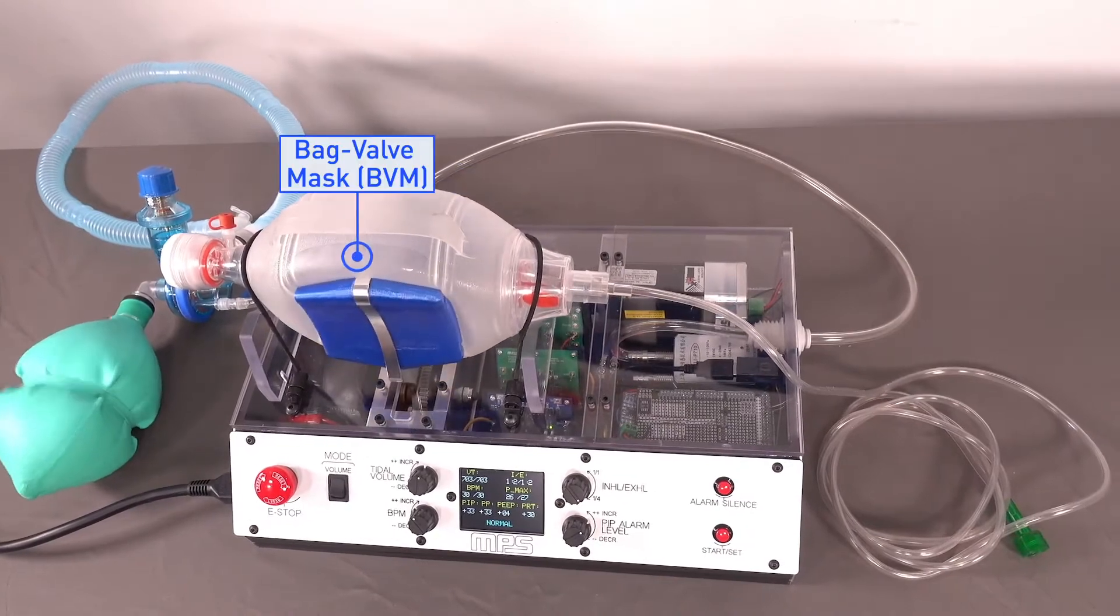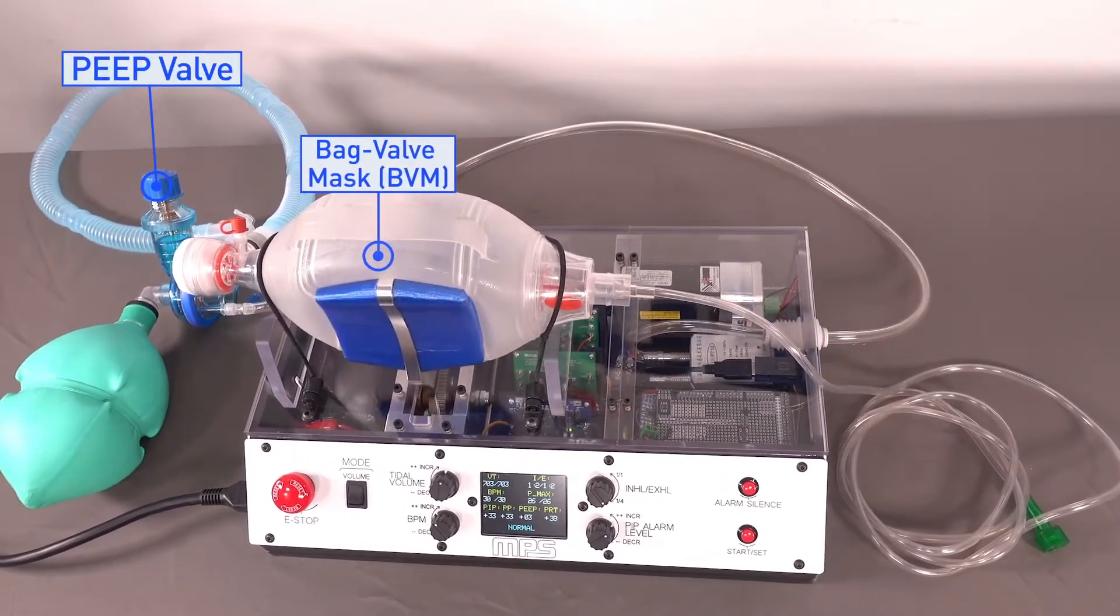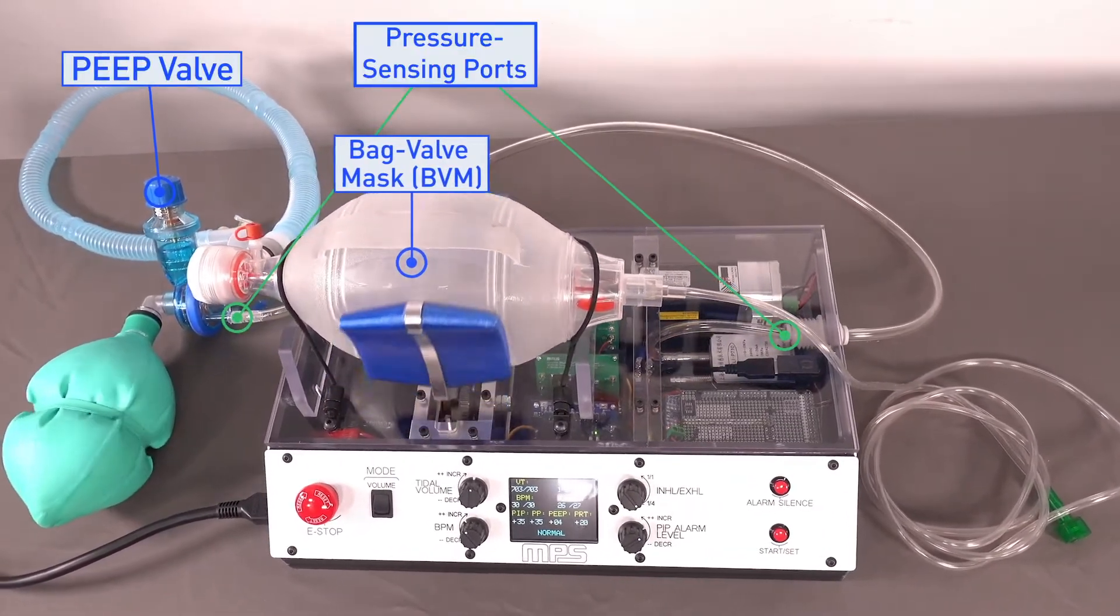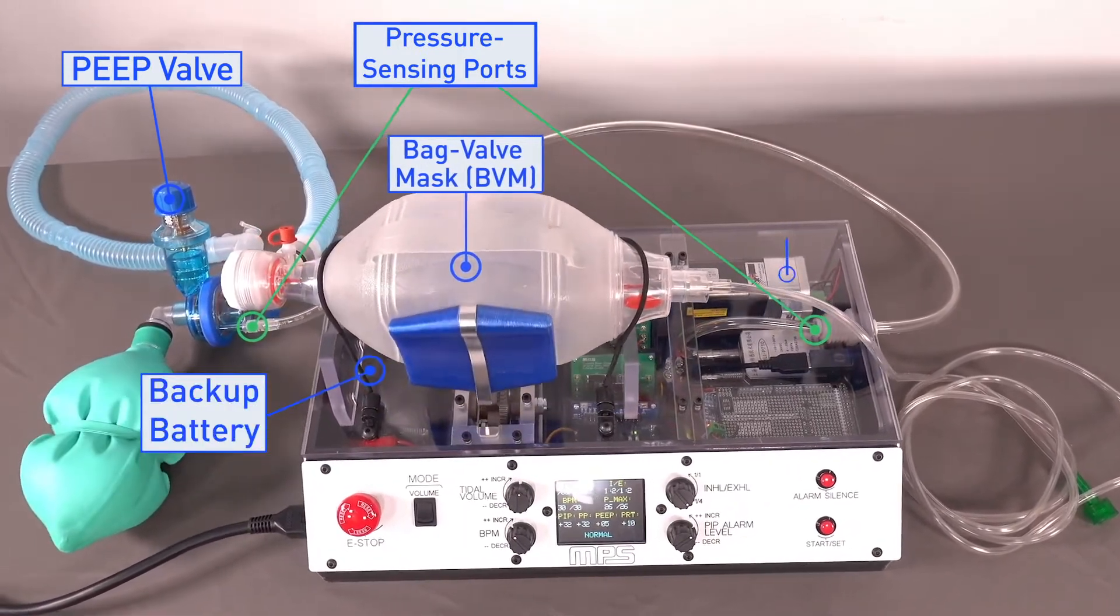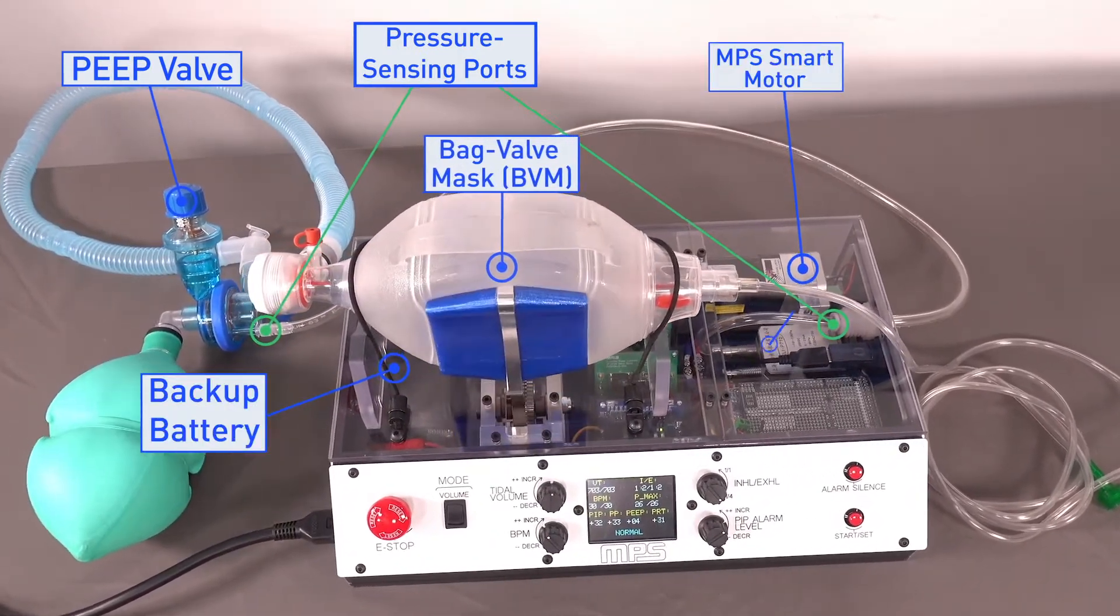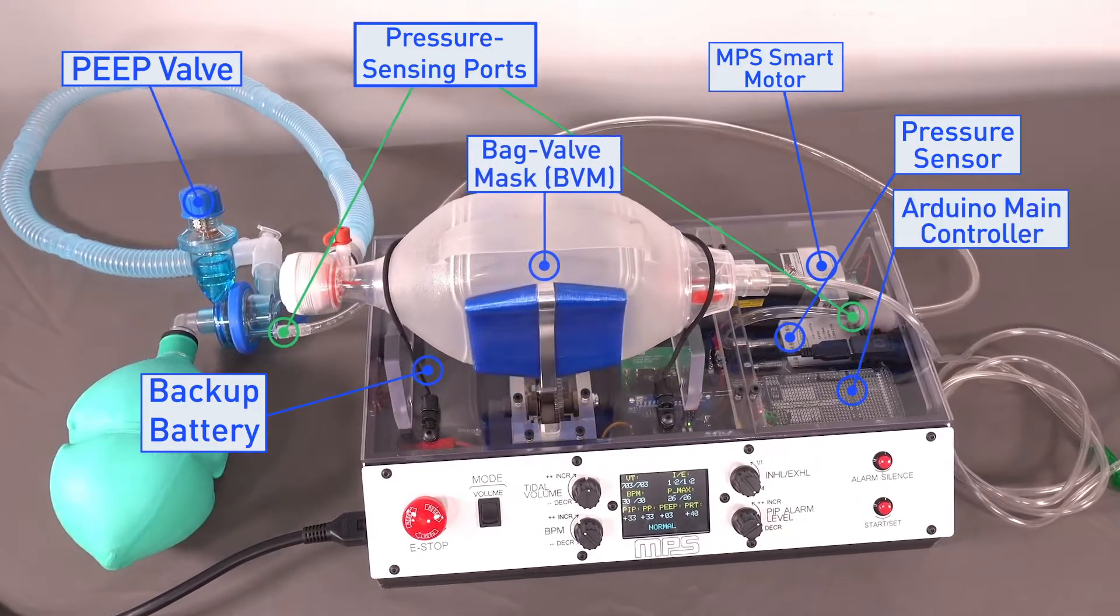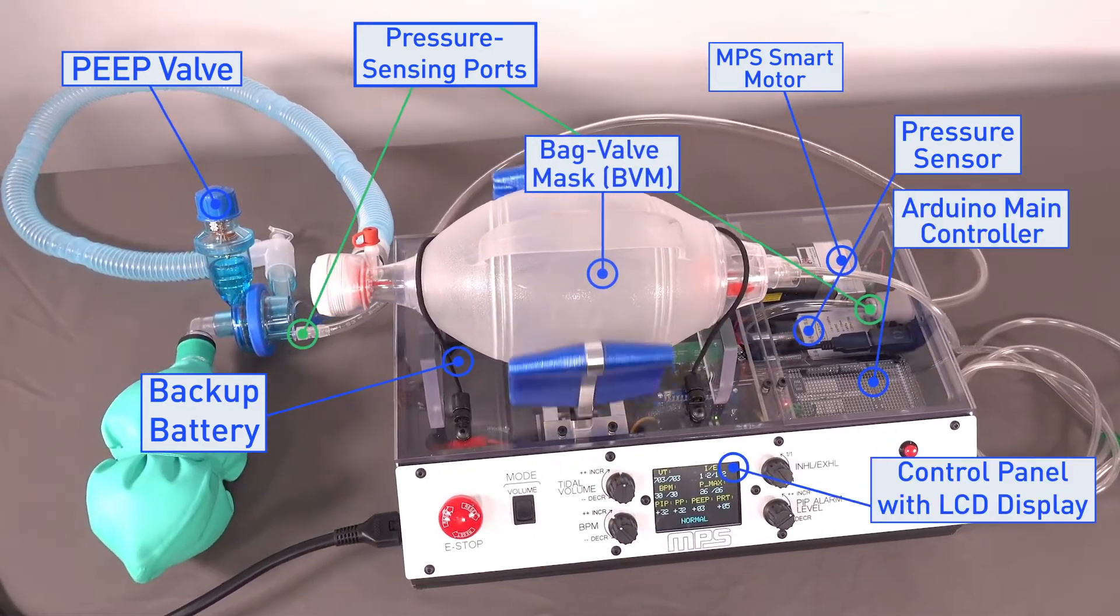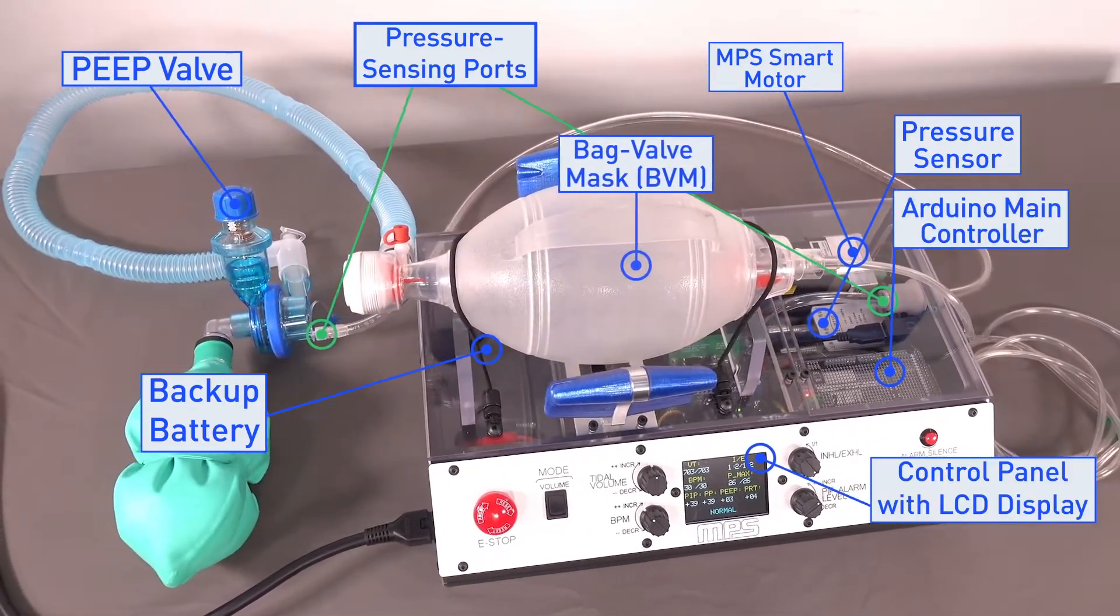The main components of the system are the commercial BVM with a PEEP valve and pressure sensing port, a backup battery, an electric smart motor drive system, a pressure sensor, an Arduino main controller, and a main control panel with an LCD display.